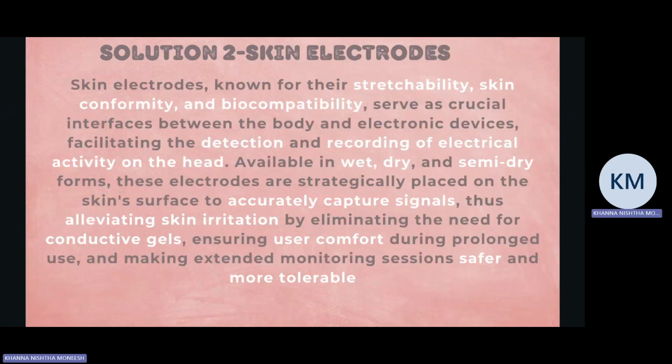The second solution are skin electrodes. Skin electrodes are known for their stretchability, skin conformity, and biocompatibility. They serve as crucial interfaces between the body and electronic devices. They come available in wet, dry, and semi-dry forms.